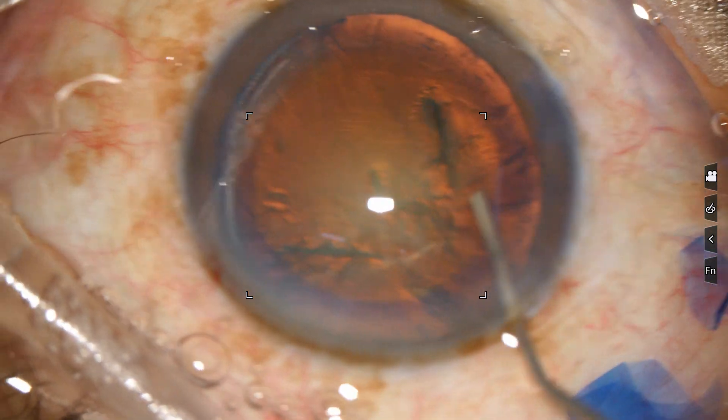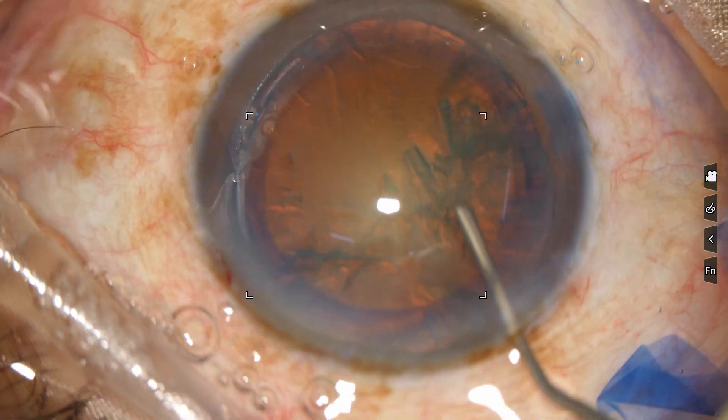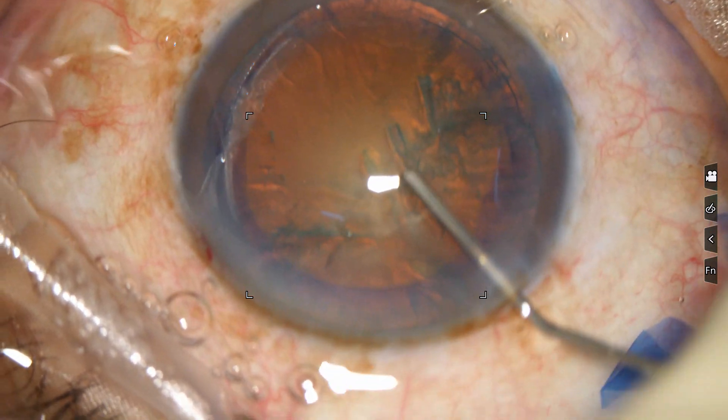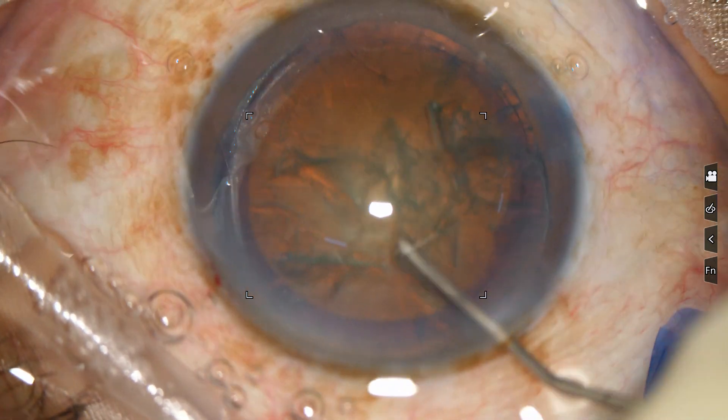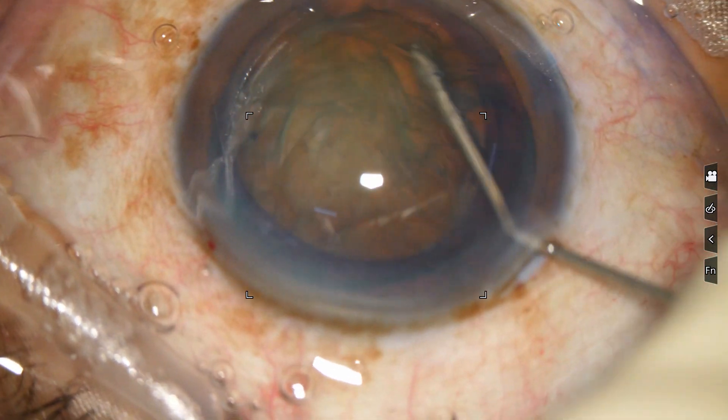Do this. Mobilize in place, and now try to rotate it. It is rotating nicely.